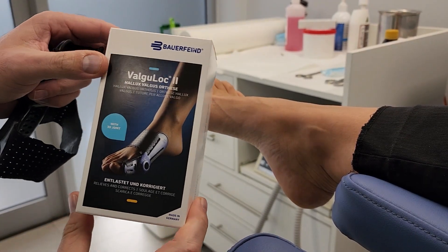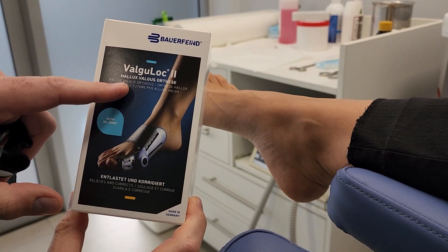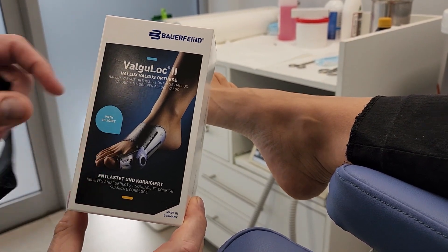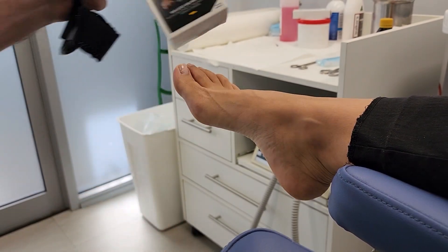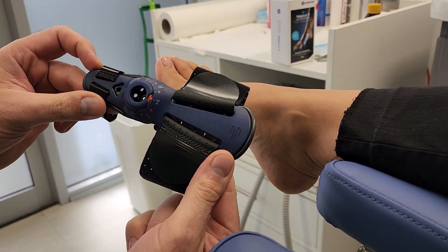Hi all. I normally don't do product reviews, but I want to talk about this brace from Bauerfeind — it's called the ValguLoc II — and I've been using this a fair bit for patients with first MTP joint pain.